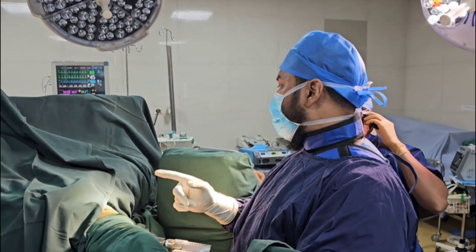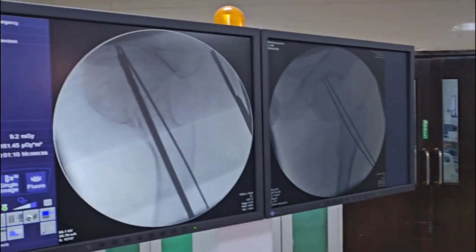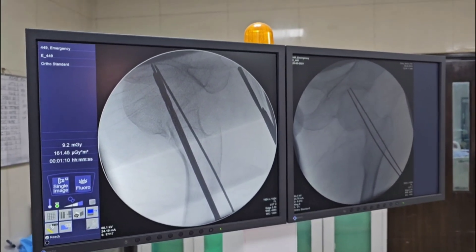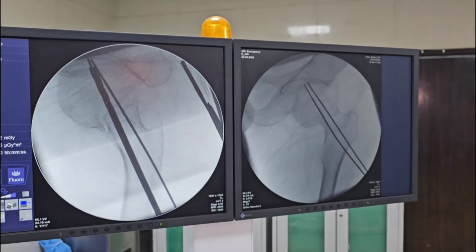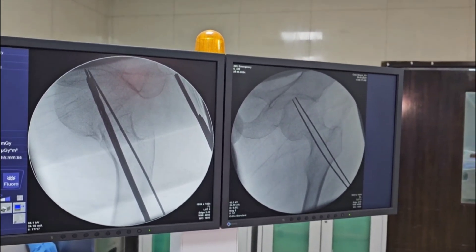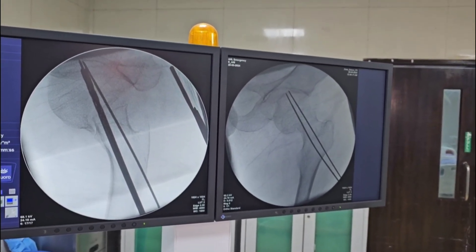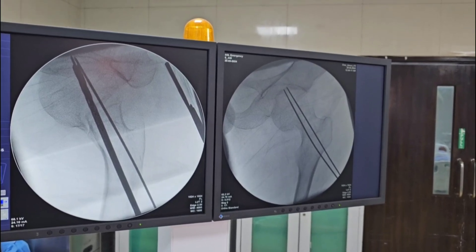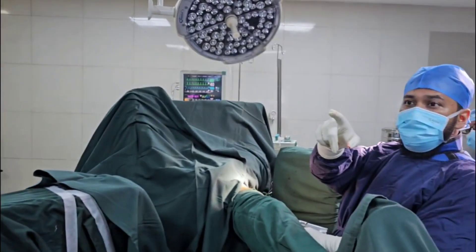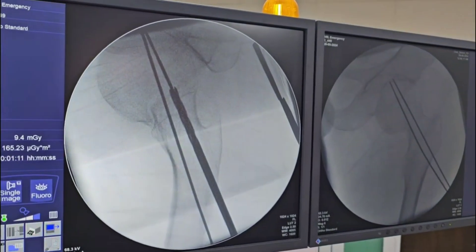As you can see, under the C-arm it is a portable X-ray. We introduced two guide wires through the neck. On the left side is the AP view, and on the right side is the lateral intraoperative view. Now through the guidance of the guide wire, we are drilling with the cannulated drill. You can observe on the left side — we are drilling the second round.